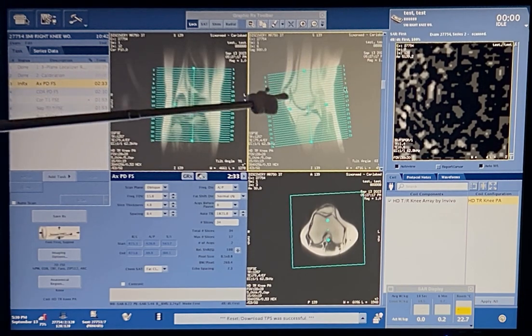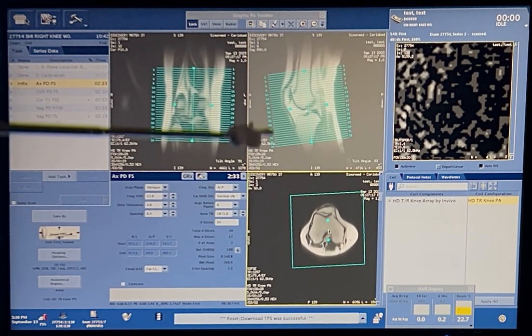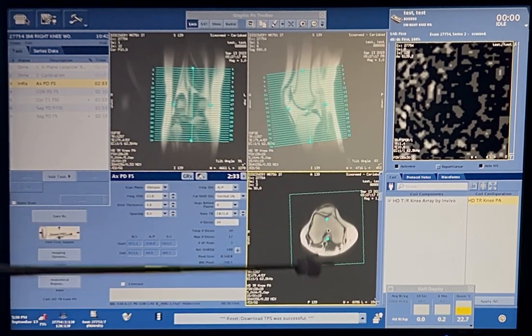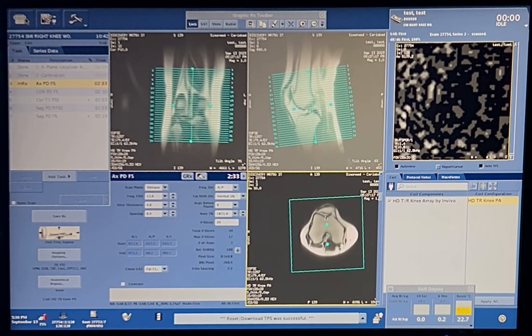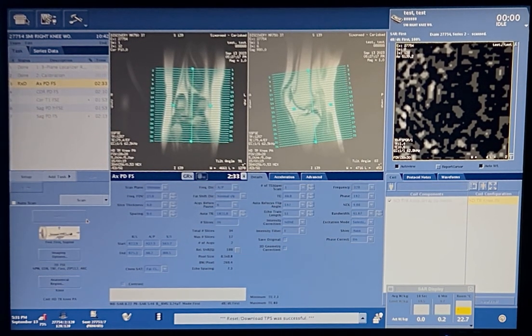Why don't we scoot it posterior a little bit? You should do it down here. That way you don't risk moving it up or down. Over here you can only move it left and right. And move it posterior. Yeah, so that one. A little bit more. Perfect. Yeah, it's a little close, but that's okay. Okay, looks good. Yep. We'll rock the 4 next because it's our only axial and we want something good to plan off of.